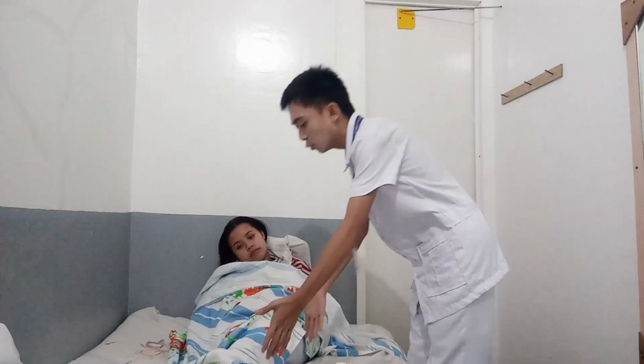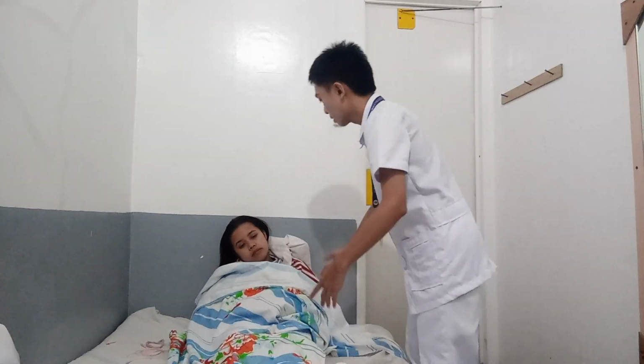procedure. Assist the client into a supine, lateral, prone, or sitting position, depending on the chosen site. If the target muscle is the gluteus medius or the ventrogluteal, have the client in the supine position and flex the knees. In the lateral position, flex the upper leg, and in the prone position, toe in. After explaining the procedure to the patient, proceed with assisting the patient in a comfortable position depending on the chosen site. Can you straighten your leg, please?